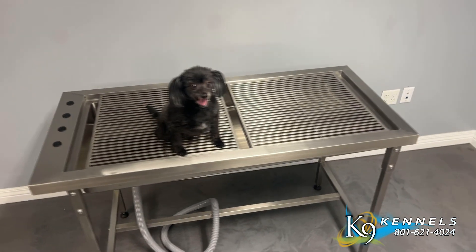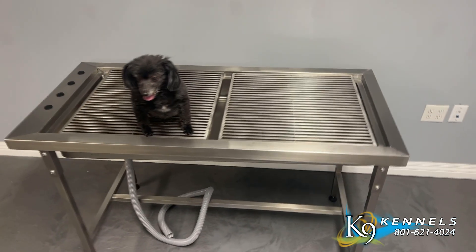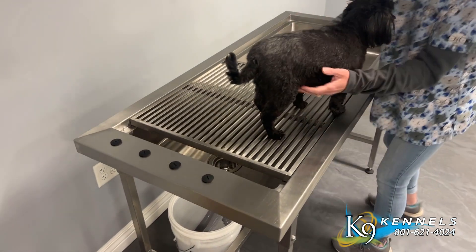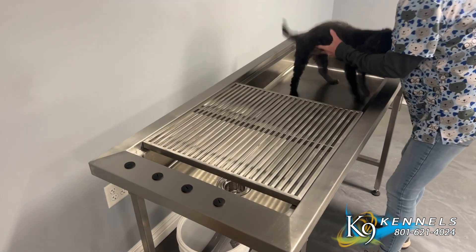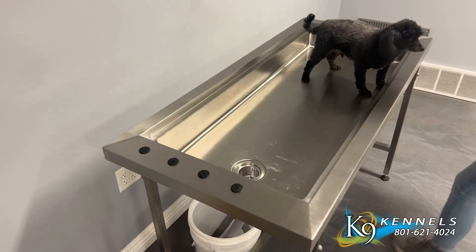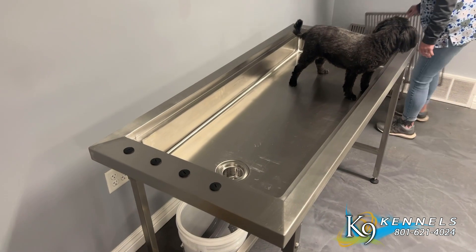Constructed with stainless steel, the Omnipro Tub Table offers rust resistance and durability, even in demanding environments. It features heavy-duty grates that provide a flat and stable surface for animals to stand on during various procedures. These grates can be lifted out and then used as a tub table.